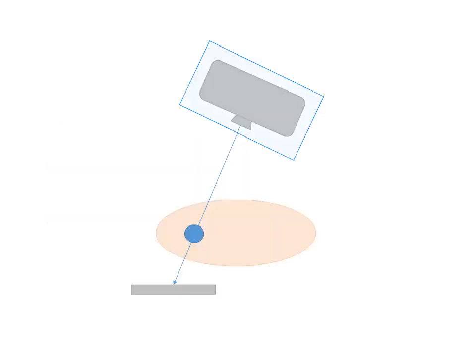Here we see the X-ray tube, patient, anatomy of interest, and the image receptor. Watch as the image receptor and the tube move in opposite directions of one another, and the anatomy of interest stays centered within the central ray, as well as on the image receptor during the continuous and extended exposure.